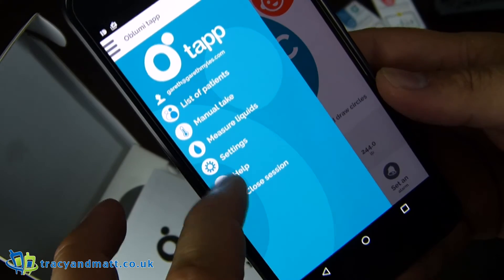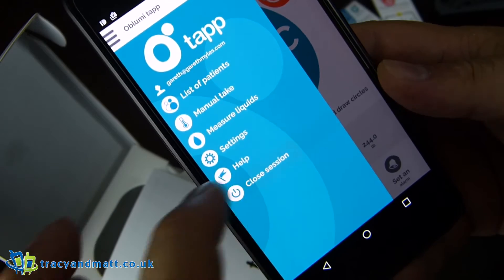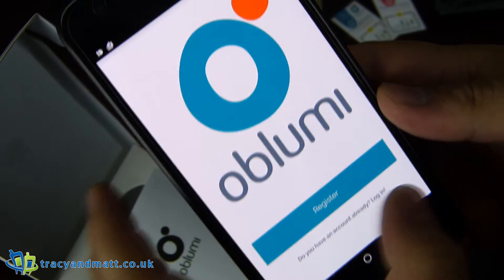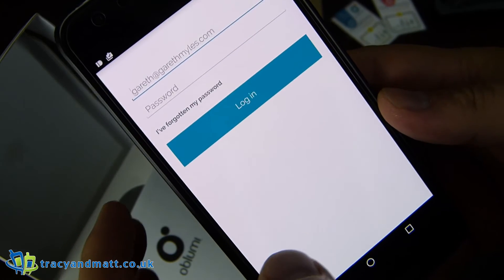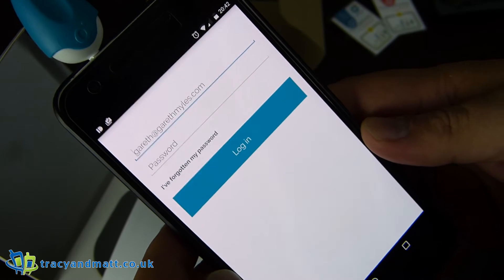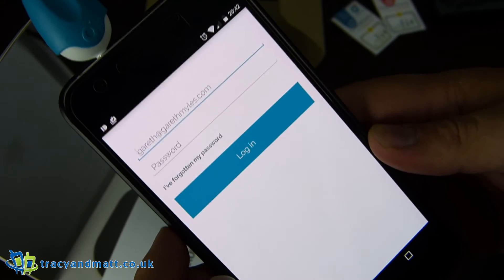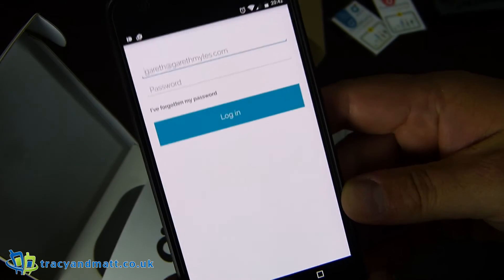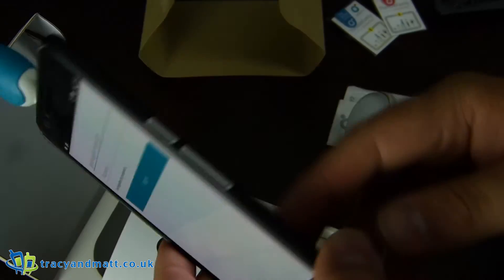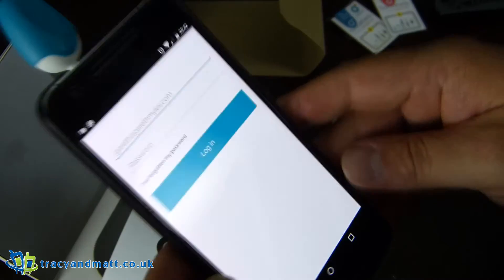Then settings, which we've already been in, help, and close session. I take it close session just quits — and it logs you out. So that's handy in case someone picks up your phone and manages to get access — they won't have access to medical records that might be stored here for children that you're looking after.